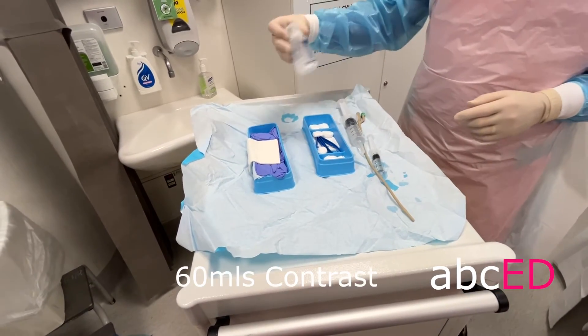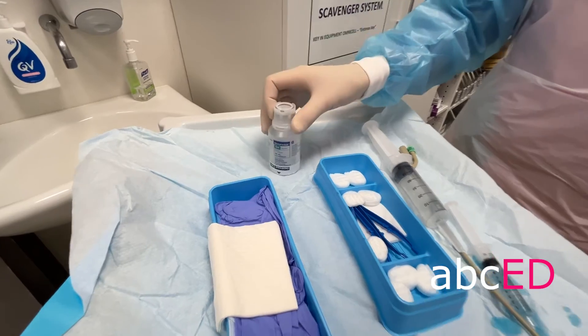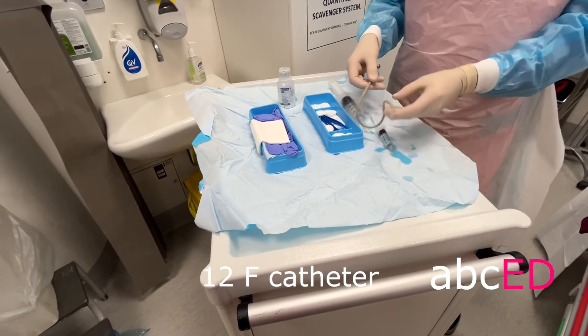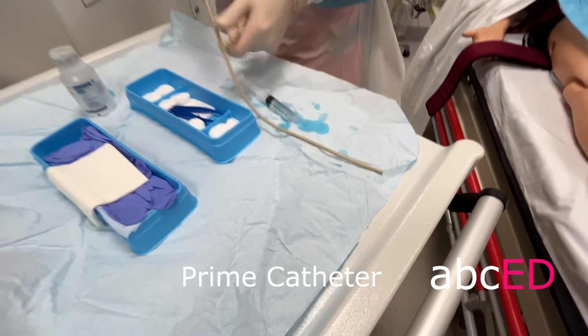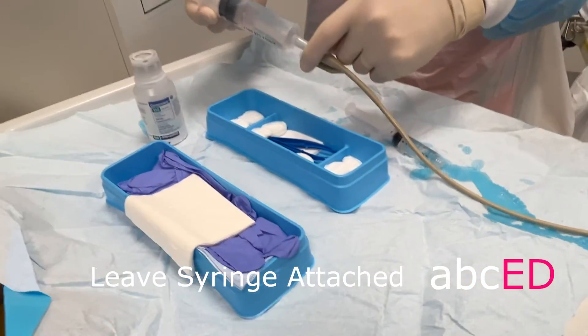Draw up 60 mils of contrast — we use Omnipaque. Use a 12 French catheter and prime it with the contrast so there are no bubbles. Leave the syringe attached.